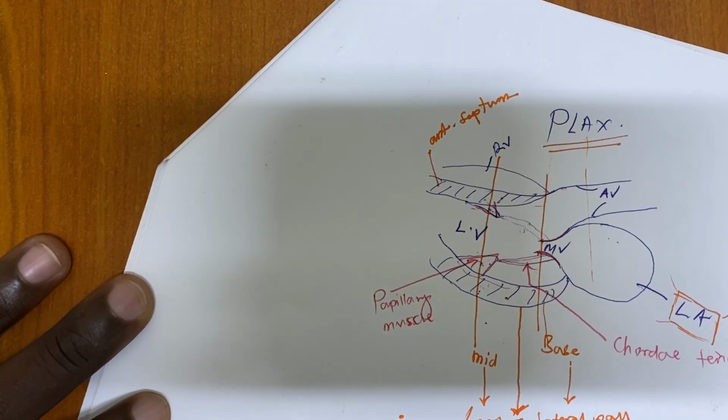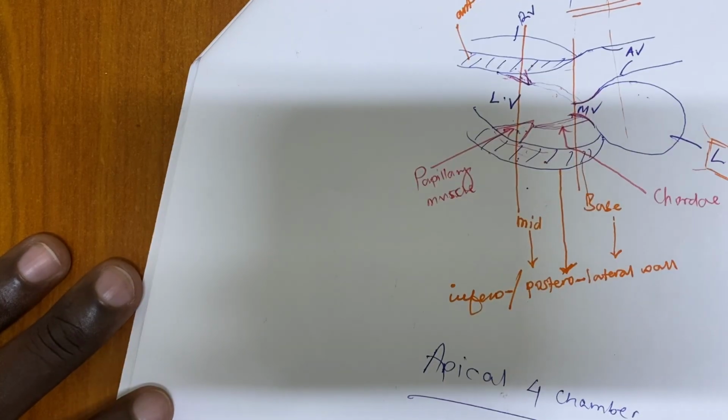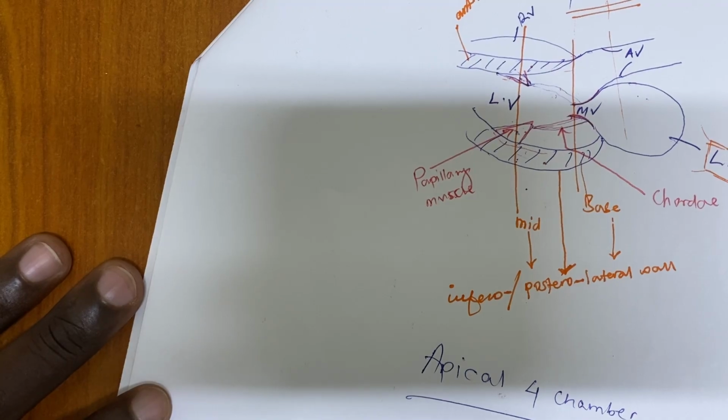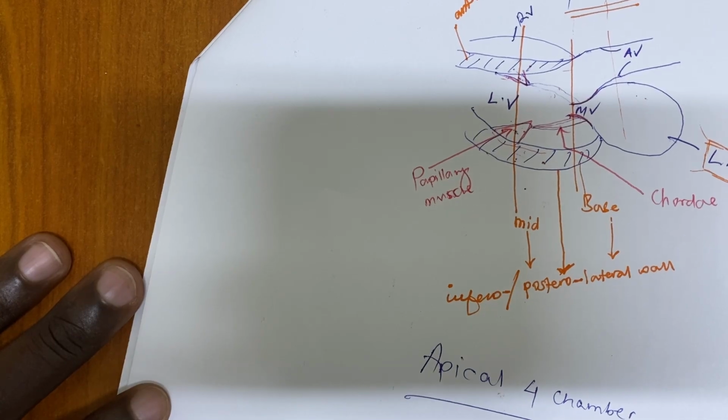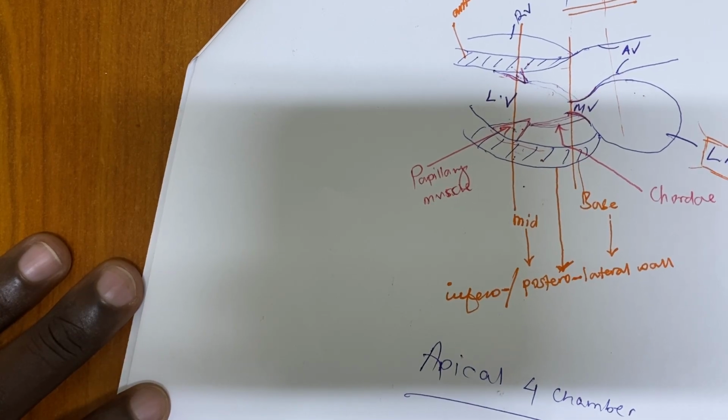How I know from the parasternal view, anterior septum and posterolateral wall, they are moving very well. I go to four-chamber, I still assess. I don't assess this one. If I want to assess this one, I will do something else. It is called TAPSE. And M mode passing here. But for this one, I will only focus on this part.